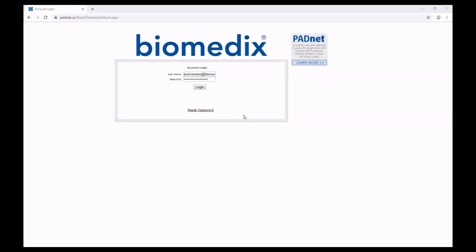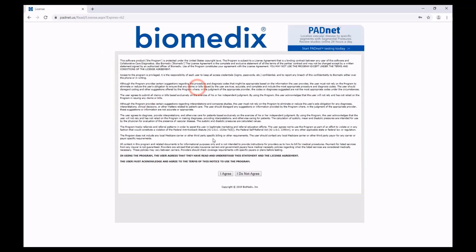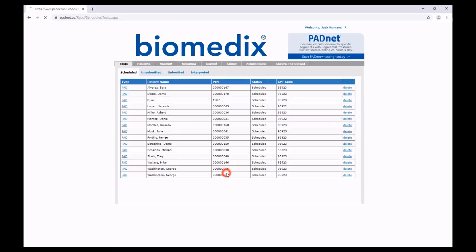In this video, I'm going to show you how to interpret a PadNet study through the website padnet.us. To start, log in and agree to the terms.